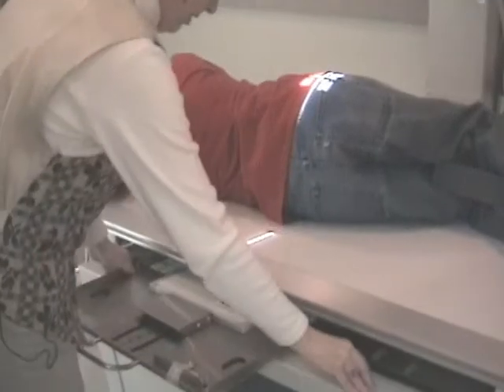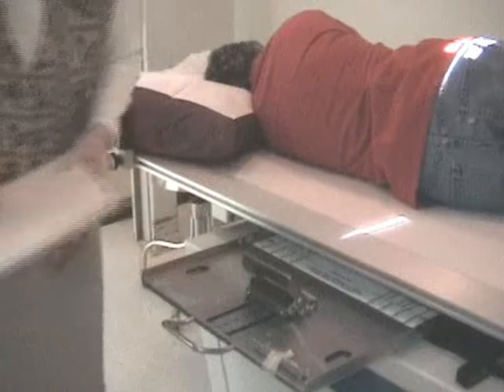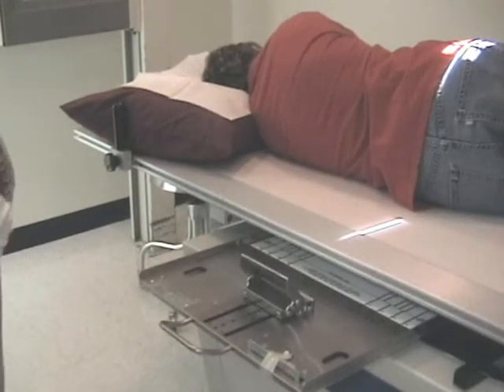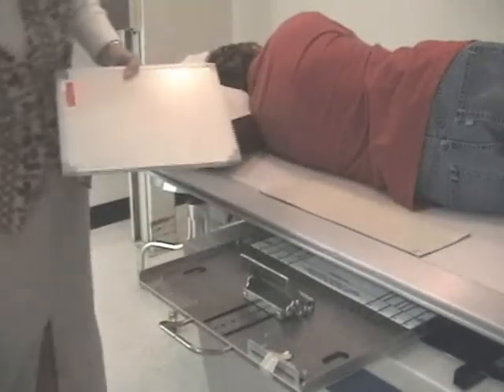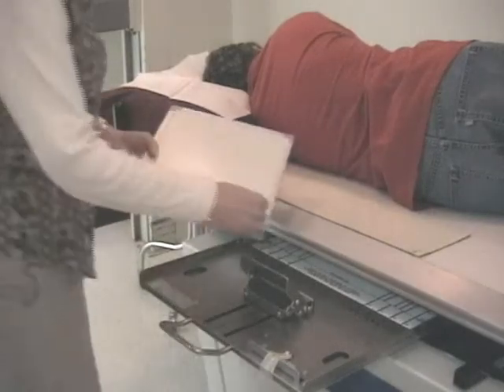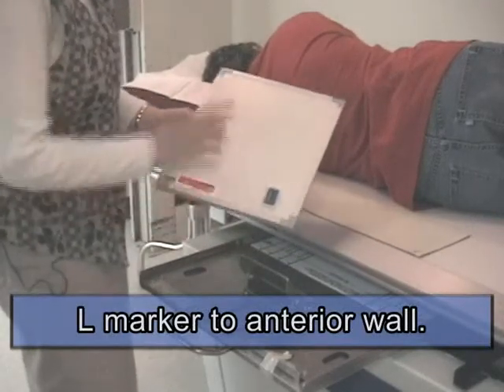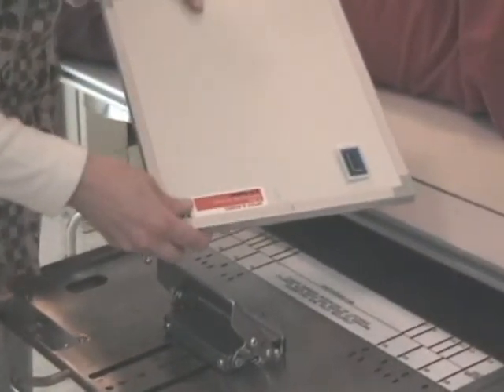I'm getting the tube approximately centered over the sacrum area. I'm going to switch to a 10 by 12 cassette, and I will use a lead blocker behind the patient, just like we did with a lateral lumbar spine. If you're using a lead blocker, you put the L marker on the anterior wall, and I'm keeping my ID blocker consistent with my APs. I moved the L marker in because I'm going to have approximately 6 by 12 inches of collimation.